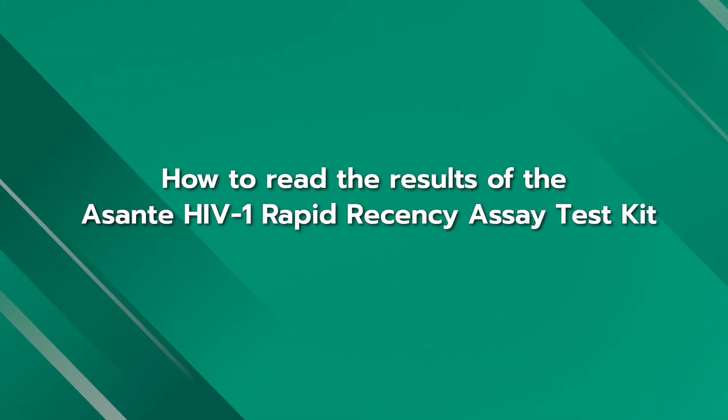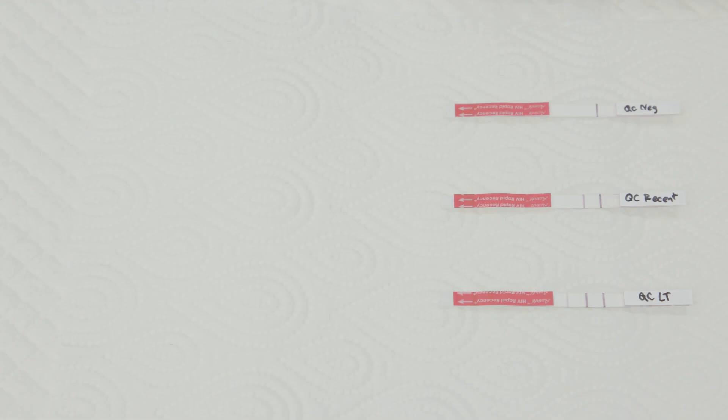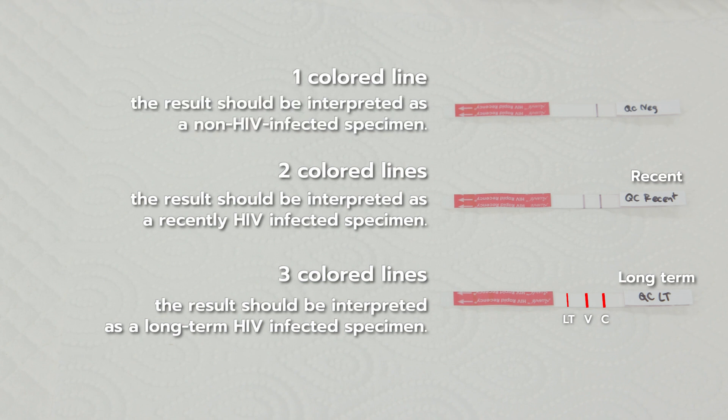How to read the result of the Asante HIV-1 Rapid Recency Assay Test Kit: If there are three color lines on the control C line, the verification V line, and the long-term LT line, the test result is interpreted as a long-term HIV infected specimen. If there are two color lines on the control C line and the verification V line, the test result is interpreted as a recently HIV infected specimen. If there is one color line on only the control C line, the result is interpreted as a non-HIV infected specimen.